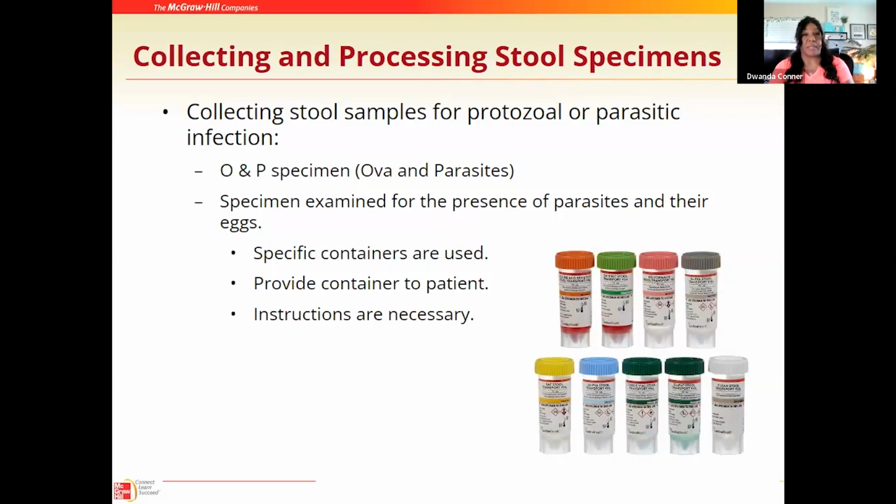I should also point out that ova and parasite specimen testing is used to examine for the presence of parasites and their eggs within the stool.